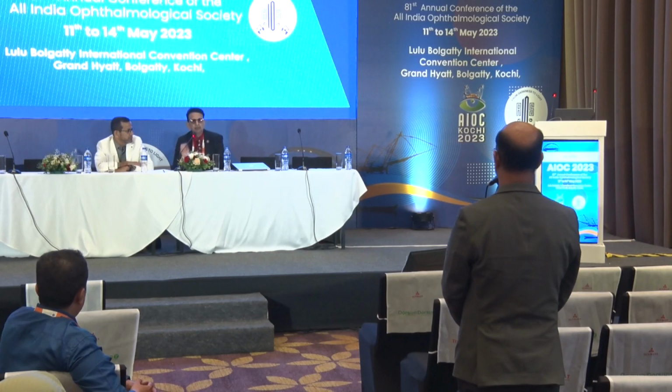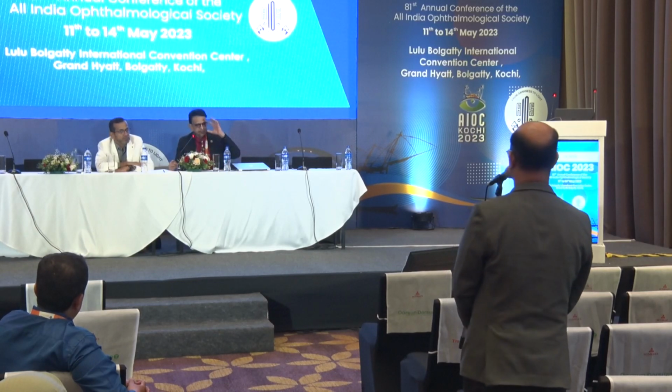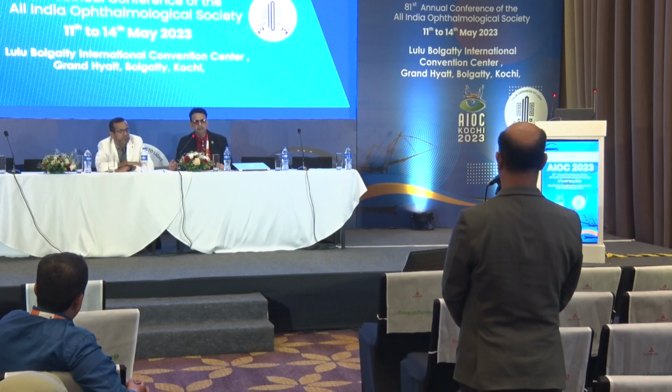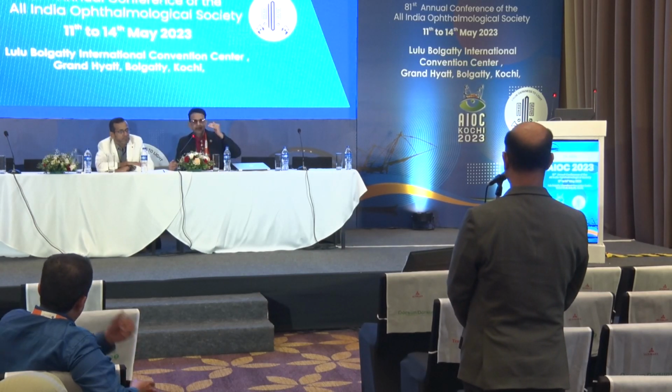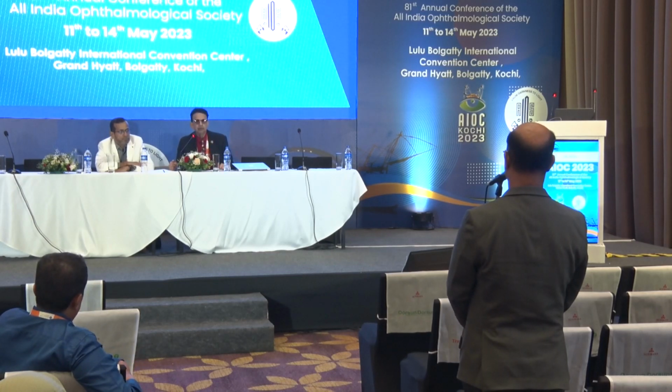It's a good question, but what happens is, we keep an offset from the posterior capsule. Normally we keep it around 500 microns from the posterior capsule, so there's absolutely no chance. It stays exactly 400 or 500 microns from the posterior capsule. In posterior polar cataract, I keep it a little more, more than 900 microns, because I don't want to go near the posterior capsule at all. So there's no chance of that.